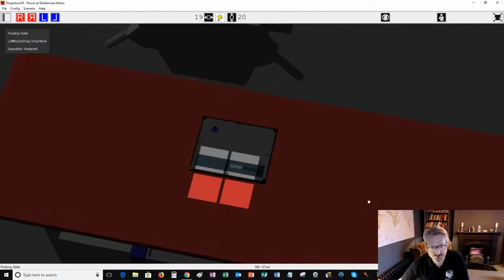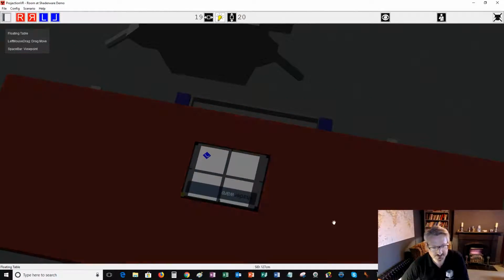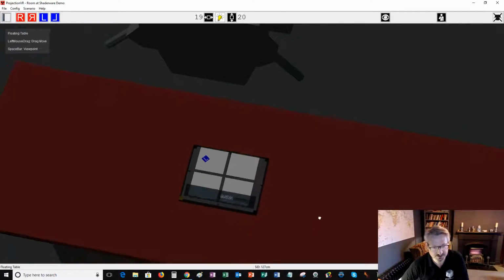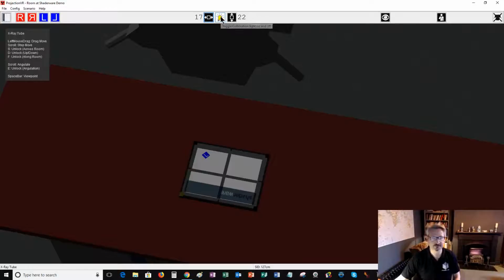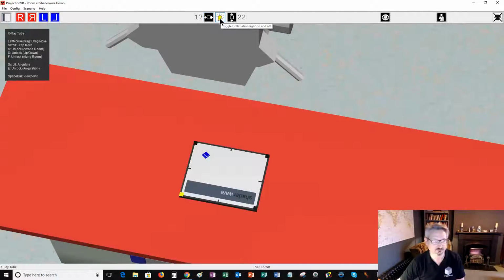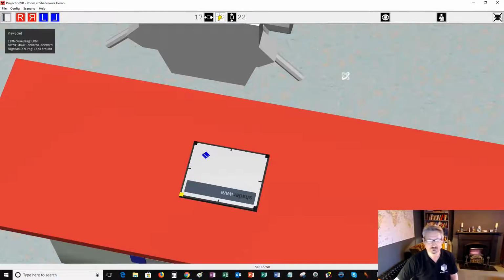What I'm going to do is move the receptor and the table so that the little check marks line up with the lines on the collimation so that I'm centering my central ray to the middle of the receptor. Okay, and now I can turn that off. If I leave it, it will turn off after 30 seconds, but if I click it, it will turn the light off for me.